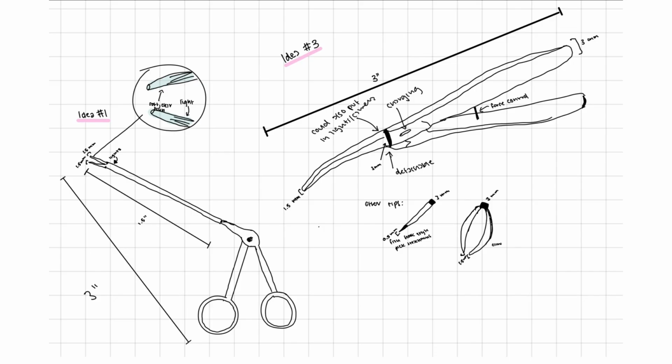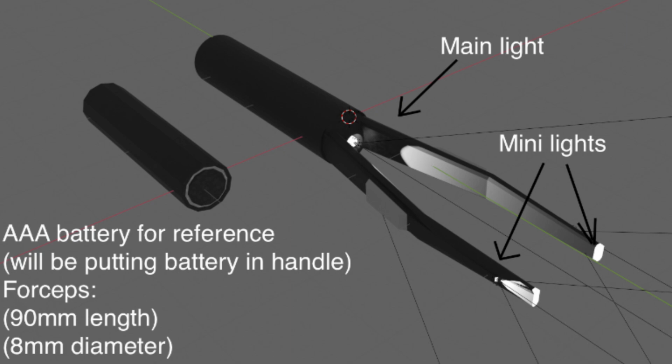We began our process by creating and comparing sketches for solution ideas. We initially intended on including interchangeable tips to accommodate the range of uses. After talking to our client, however, we decided that this would hinder the ease of use and instead created a compact design so the forceps could be easily carried and stored. To effectively illuminate the object or surface the forceps are being used on, we decided to incorporate lighting at the very tips of the forceps prongs.